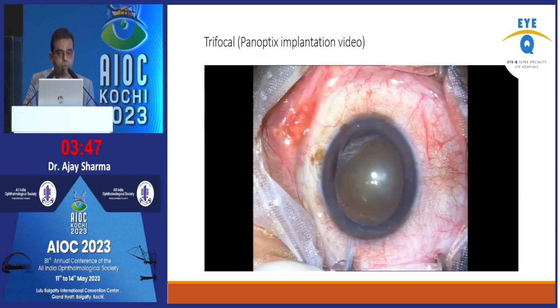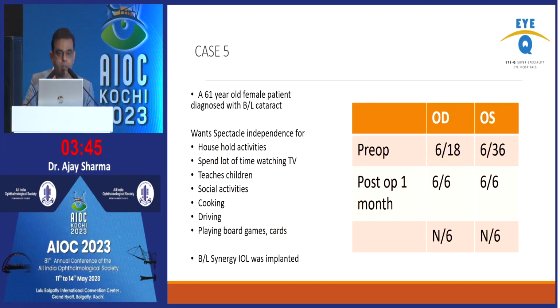So this is a video I'll skip, and this is another case. So here was the case when Synergy was implanted.